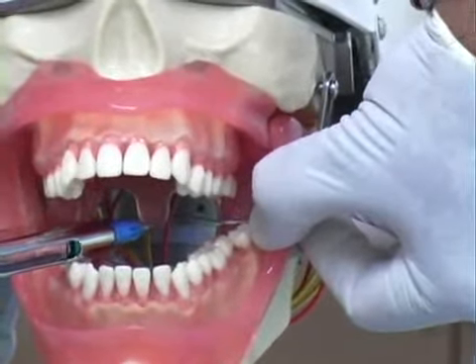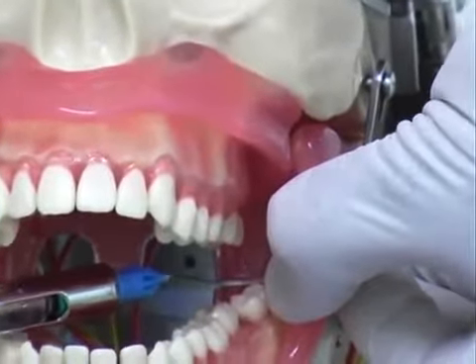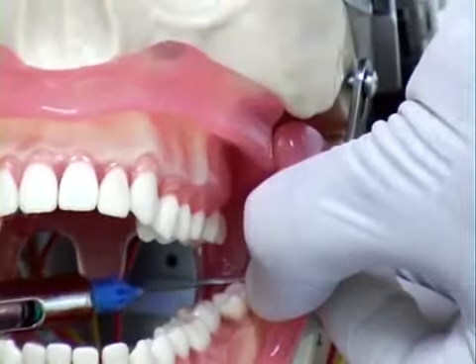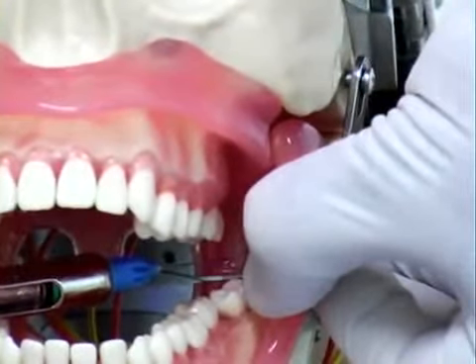You can have an injection point here, 5 millimeter medial to the coronoid notch and about 1 centimeter above the occlusal plane, which is here.